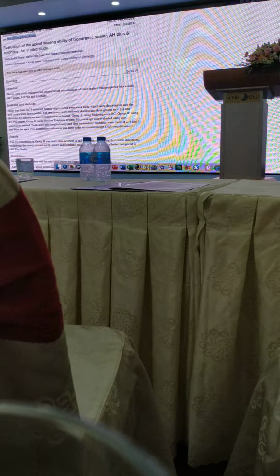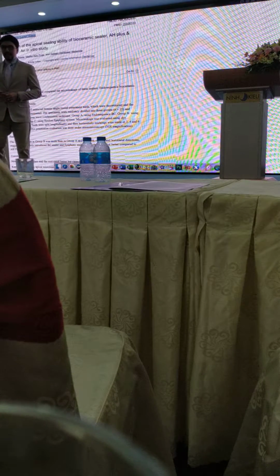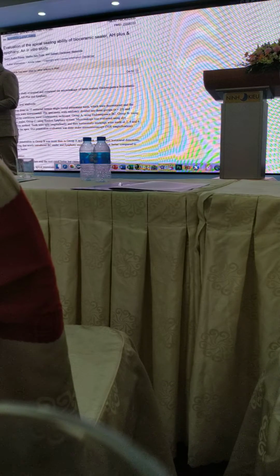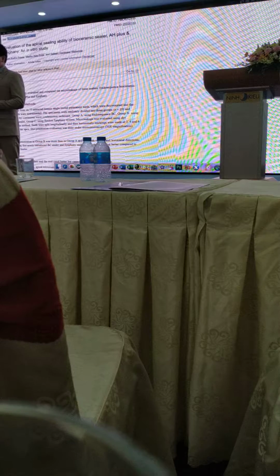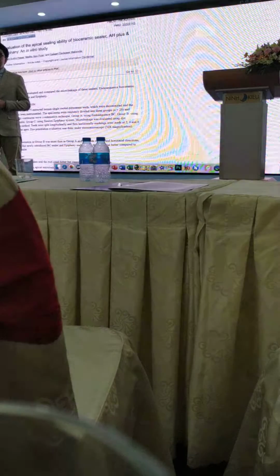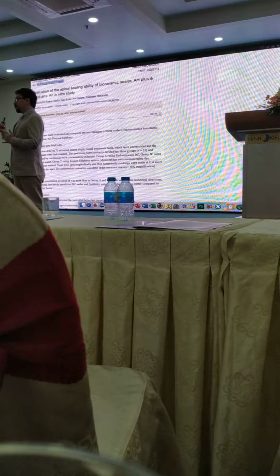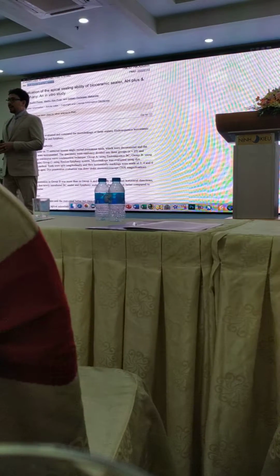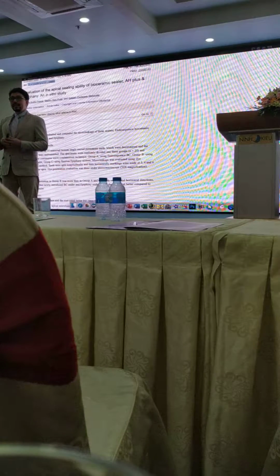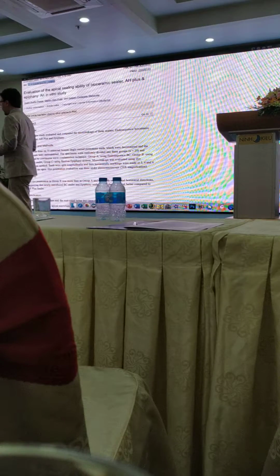And we are going to see a nice clinical case in which we can analyze everything we have talked about until now. With that case, you will be able to see the importance of having files with a high resistance to cyclic fatigue. We will see the importance of combining techniques sometimes, and the importance of having the opportunity to offer our patient different techniques, because not all cases can be managed in just one way.